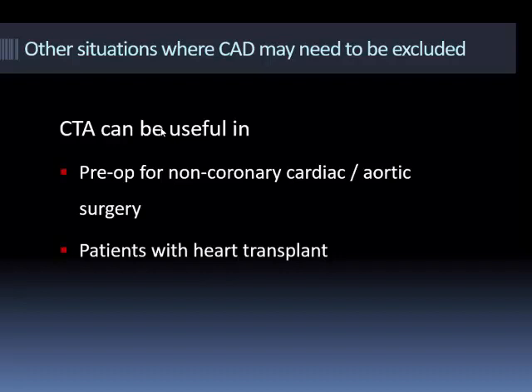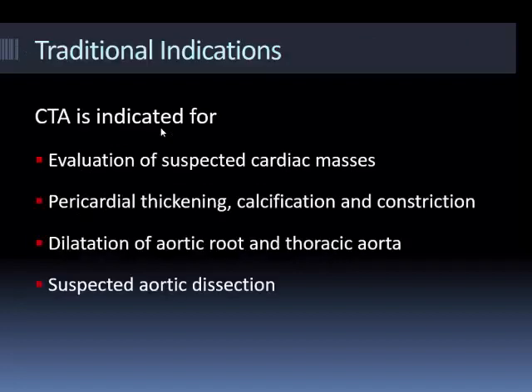And Taryn's done lots and lots of work on heart transplant patients. In transplant patients, you have to cath them yearly because they have an increased risk of atherosclerosis, accelerated atherosclerosis, and they're asymptomatic. So it's always been a challenge in managing those patients.